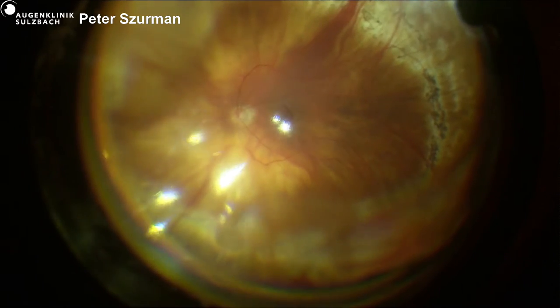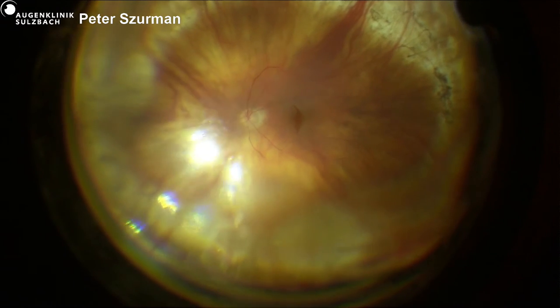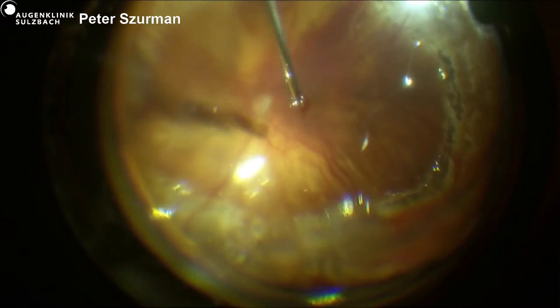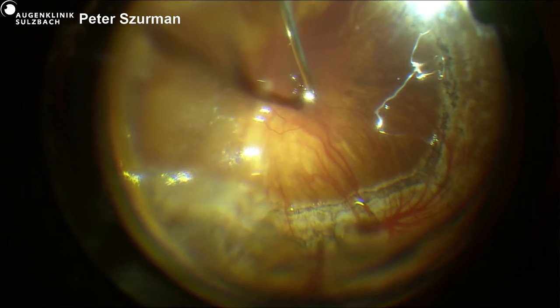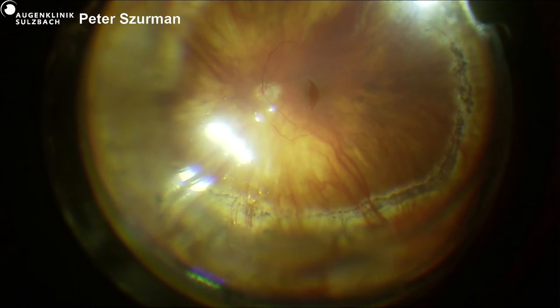PFCL. And I try to protect the subretinal space so that the staining ink will not enter the subretinal space. I'm not sure if this is successful, but I try to protect it with the PFCL bubble.